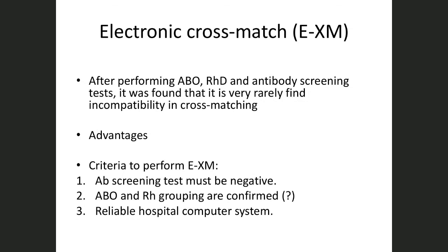Let's briefly talk about electronic cross match versus serological cross match. In electronic cross match, there is no cross matching at all. Okay, so there is no serological cross matching. It's just the computer, or the system, that will tell us which unit we have to transfer.